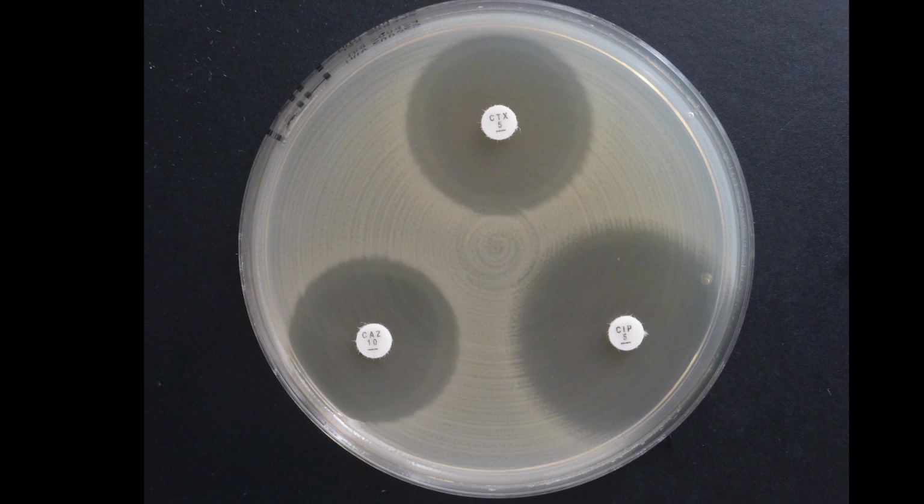When you have a fuzzy zone edge, you should look at where your zone diameter is, where your zone edge is. You should not look at each and every stripe that might be a result of streaking the plate. You look at the whole picture and estimate where your zone diameter is. You should never hold the plate up to light or use a magnifying glass if that's not specifically recommended.